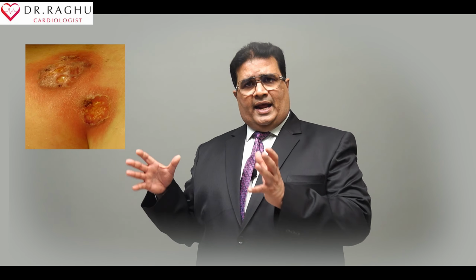Cardiac resynchronization therapy, despite being an excellent advance, like any surgical procedure, has a 1 to 2% risk of a procedure-related or device-related infection. These infections are a big nuisance and sometimes life-threatening. So all aseptic precautions should be employed, and the utmost diligence should be exercised by the treating team to achieve a zero infection rate. That's number one.